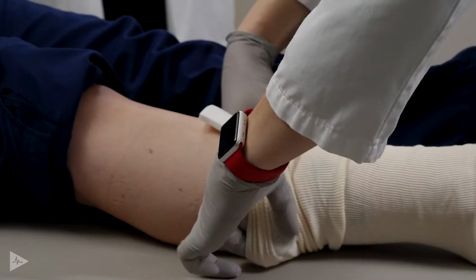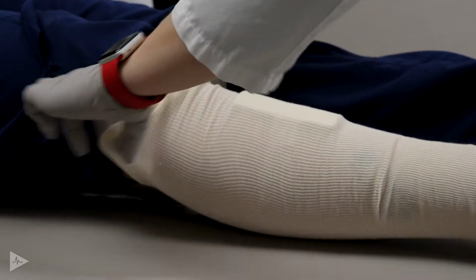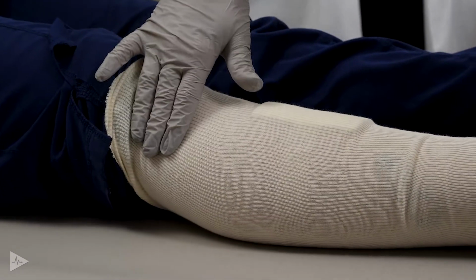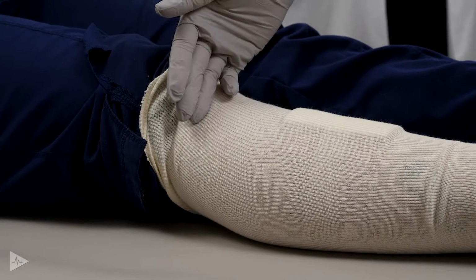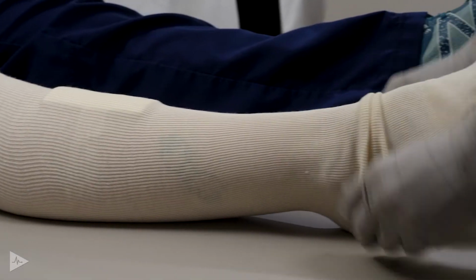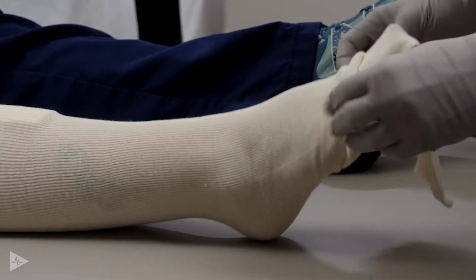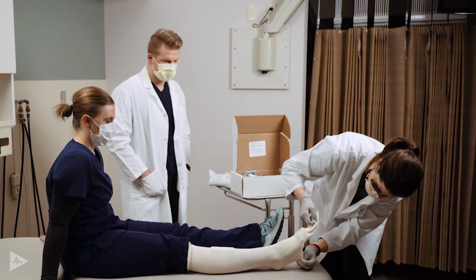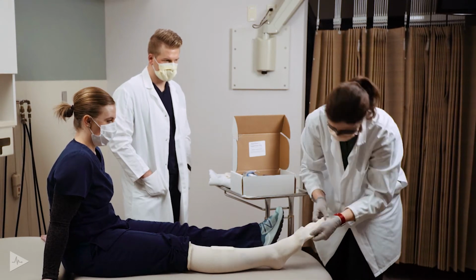As you apply this, you just want to make sure the foam is not rolling or bunching. You want enough above the top end of your cast so you'll be able to roll this down in a future step. I want to try to get all the wrinkles out of the stocking. Make sure that foam piece is nice and flat.